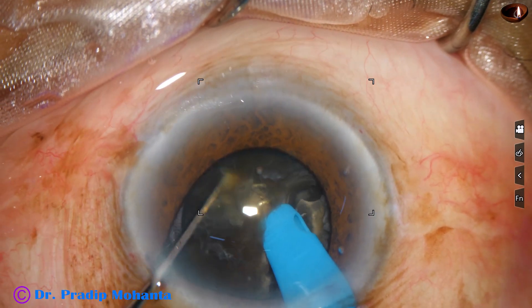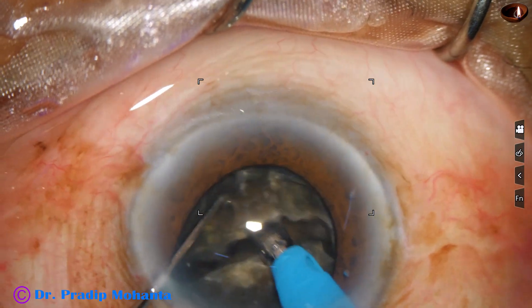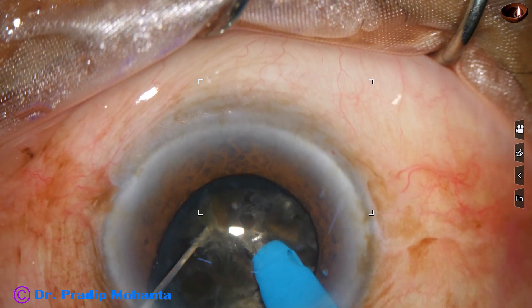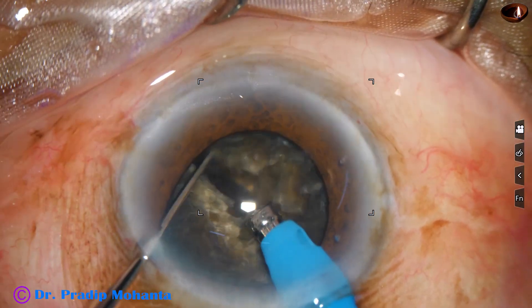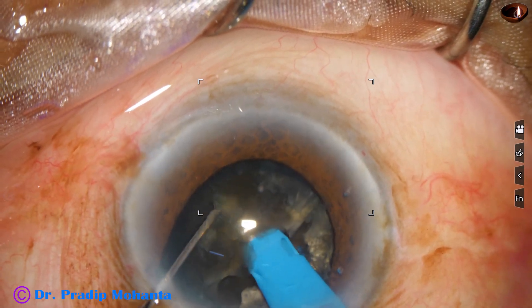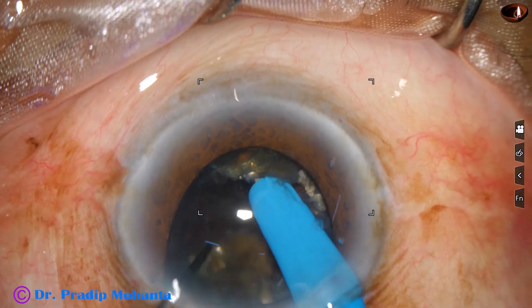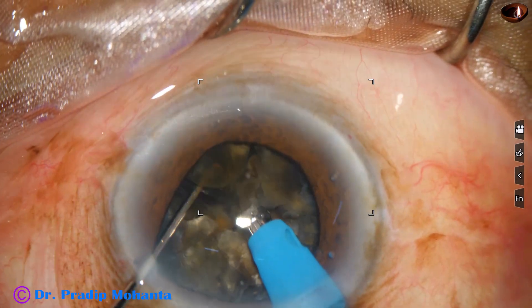Each hemi-nucleus is being subdivided into several parts. This is one fragment of the hemi-nucleus, and the bigger piece is subdivided into two — we get three pieces. The other hemi-nucleus is divided into two pieces, and now we have five pieces in total.